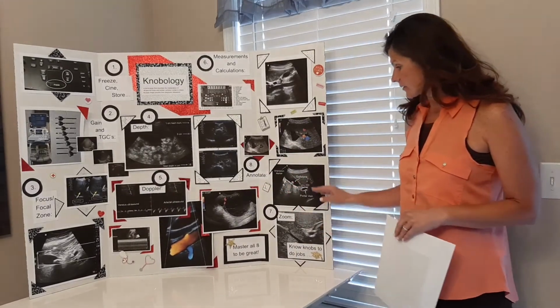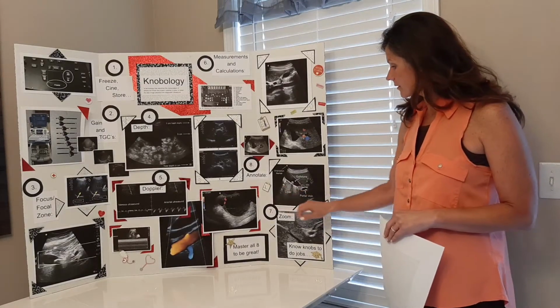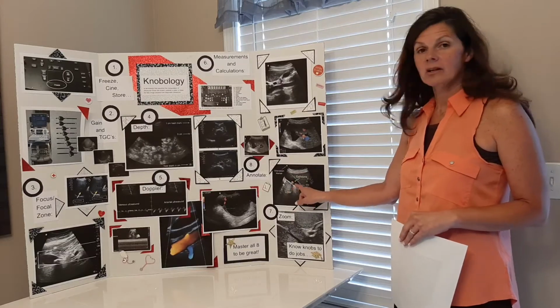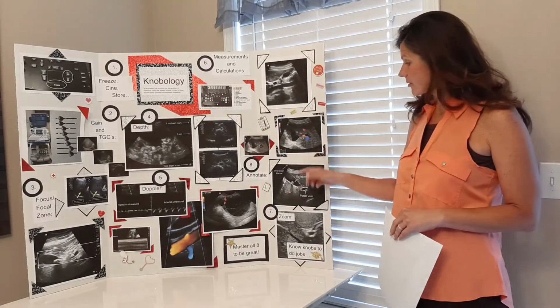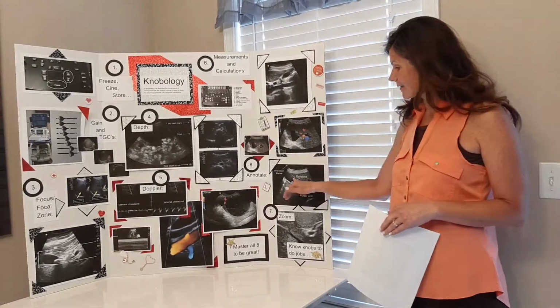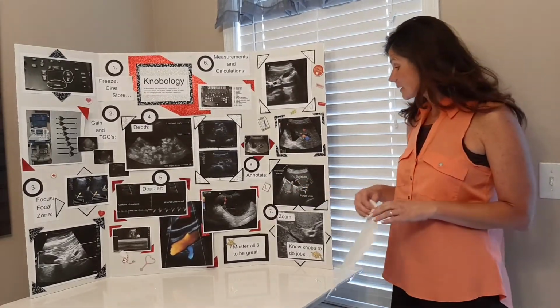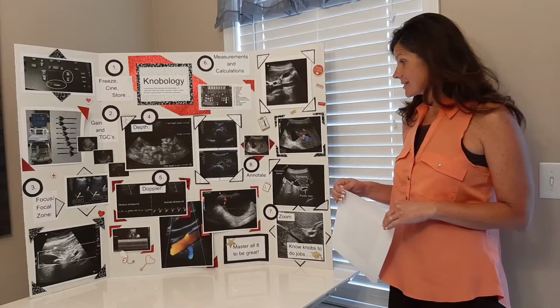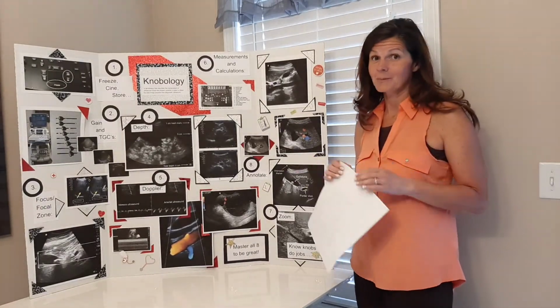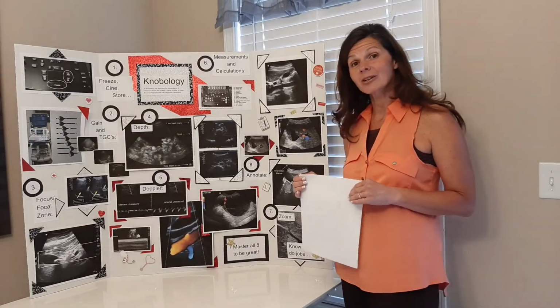In this particular image, they've actually labeled the liver and the portal vein, and inside the gallbladder there's actually a gallstone. They actually placed an arrow indicating here's some pathology for you to look at, and they labeled it gallstone. Annotations are important. Again, it helps the radiologist know exactly where you're wanting them to focus their attention and which body part you're actually imaging.